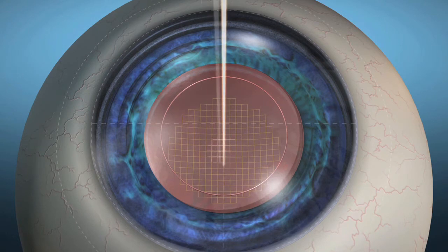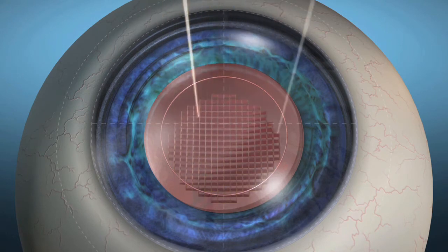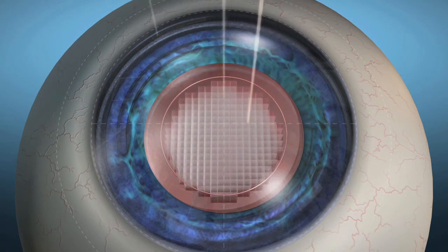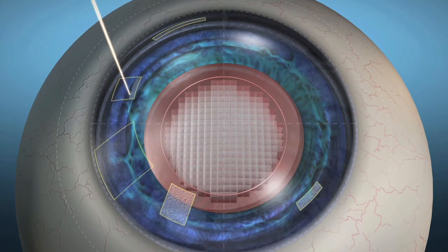By adjusting the depth, size, and location of each pulse as it fires, the LensX laser can create a wide range of cuts on multiple types of tissue.